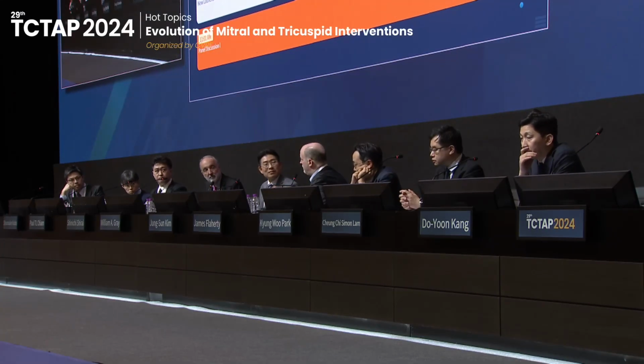And I think you showed an example of a commissural lesion where, in my experience, there's less entrapment of the device as you try to make multiple bites at it. So it seems like it's a little safer for some of that treacherous anatomy. What other situations do you like the PASCAL over the MitraClip?